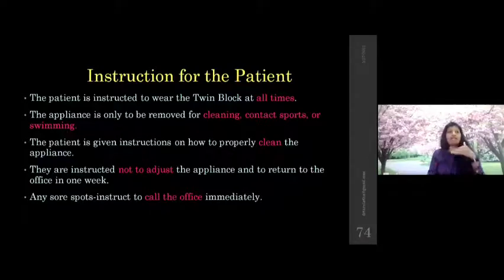Apart from that, give him cleaning instructions. You are supposed to ask him to clean the appliance daily, either using denture cleaning solutions or denture cleaning tablets, or else you can use an old toothbrush along with toothpaste to clean the surface of your twin block and then wear it. Because it is an appliance with which all functions need to be performed while wearing it, it is mandatory that you clean the appliance every day.